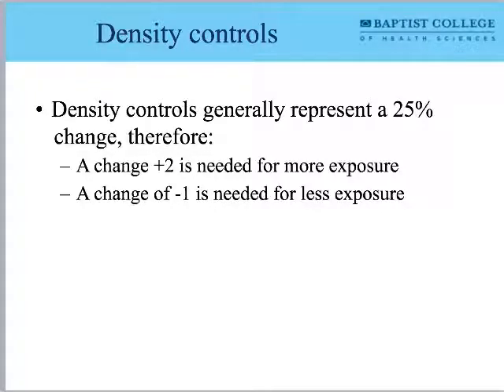Density refers to darkness or exposure. Brightness refers to something that's unexposed. So bones appear bright because there's decreased exposure wherever bones are because of their mineral density and their thickness. Can you say that again? Density refers to blackness. Brightness refers to whiteness.